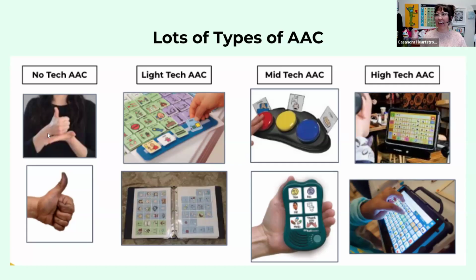Having light tech and having some words available there can be really beneficial. Mid-tech buttons, I really love for super repetitive activities, like thinking about your students coming through the door in the morning and having a mid-tech with three options and you say, "Hey, how's your morning been?" And one of them says, "It's been great." And the other one says, "I don't want to talk about it." And the other one's like, "I'm okay." So regardless of your students' communication skills, they can participate in that very repetitive morning ritual.